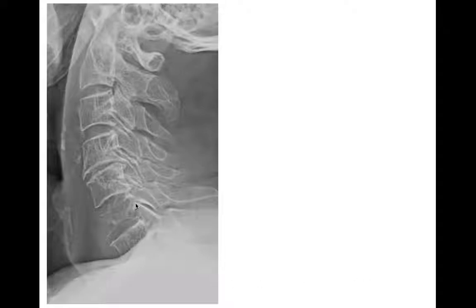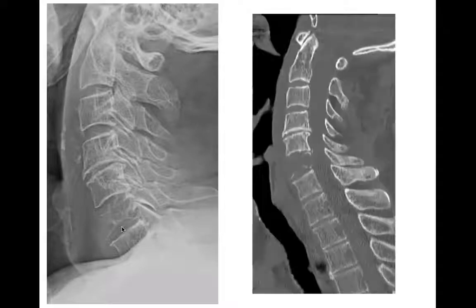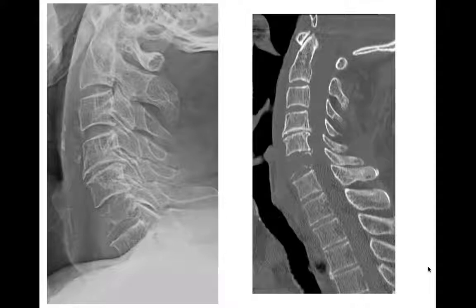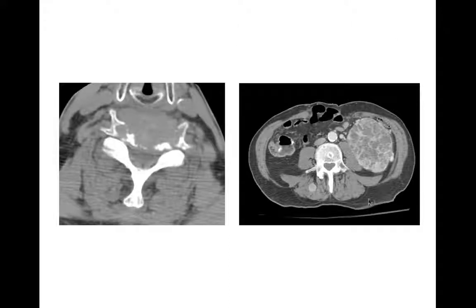Here's a radiograph of an older patient with a lytic lesion involving the vertebral body, better seen on CT where most of the vertebral body is taken up by this lytic process. With an older patient, we worry and think mets and multiple myeloma because of age and how common they are. The CT also showed a giant renal mass — this was renal cell carcinoma. Remember, renal cell carcinoma and thyroid carcinoma are the prototypical ones that give you expansile lytic metastases.